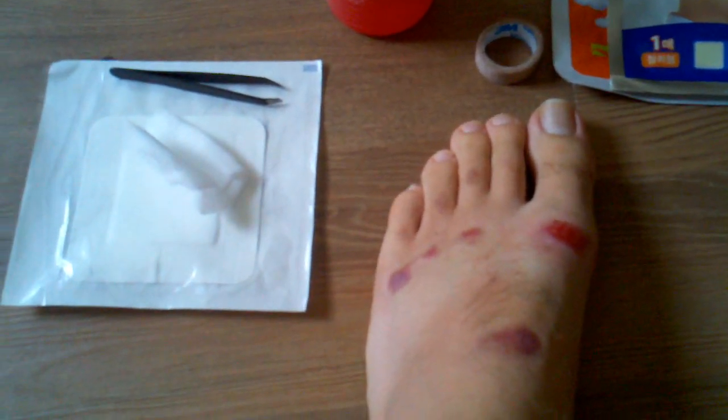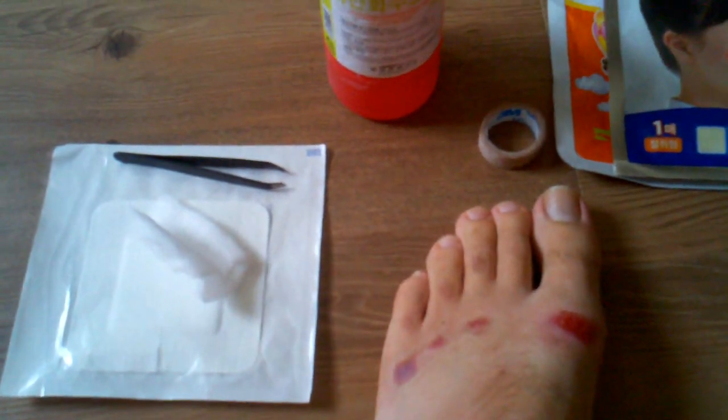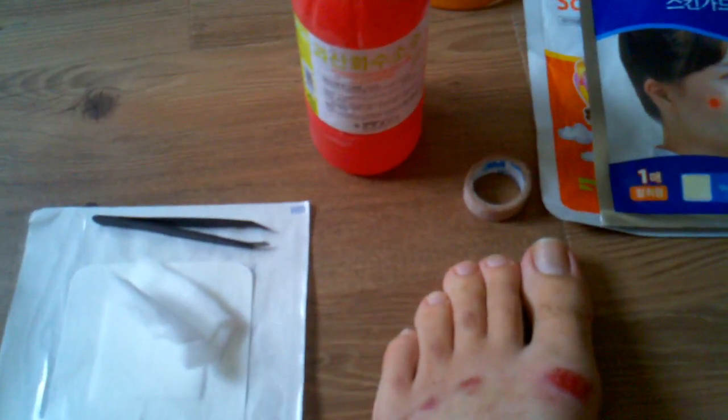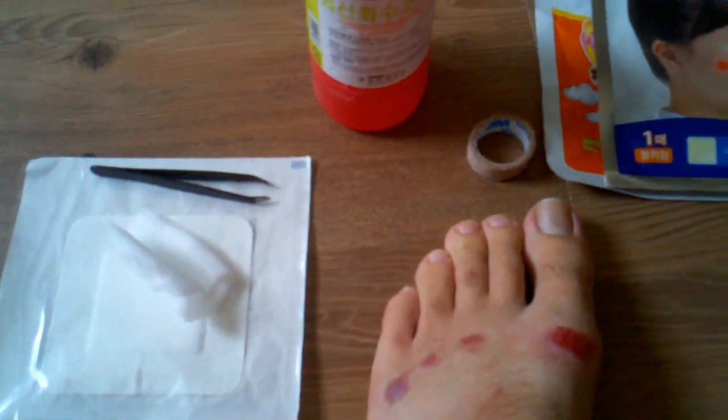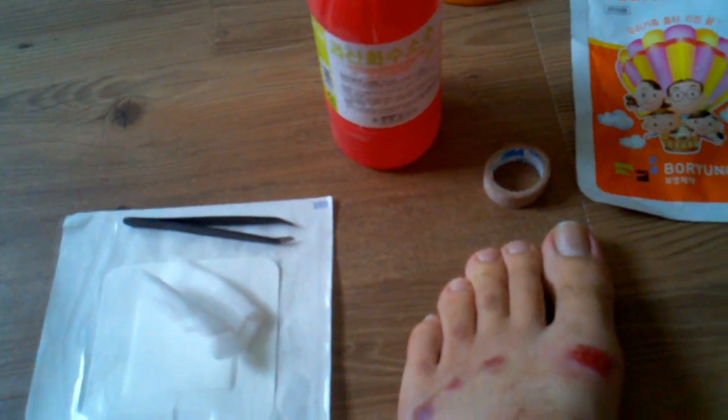Hello, I'm going to show you how to properly dress road rash using hydrogen peroxide. 3M makes this stuff. It's a synthetic skin essentially. You put it over the road rash.